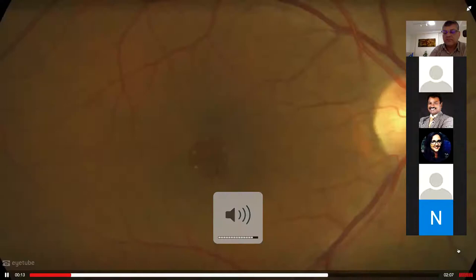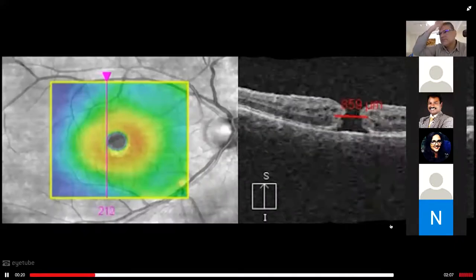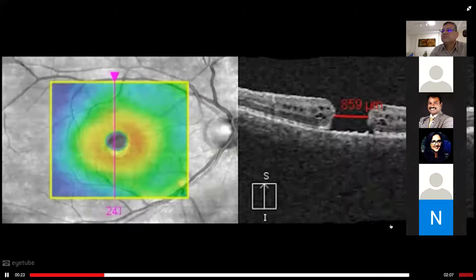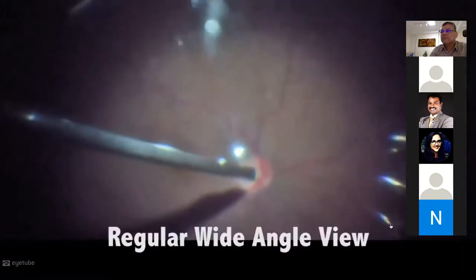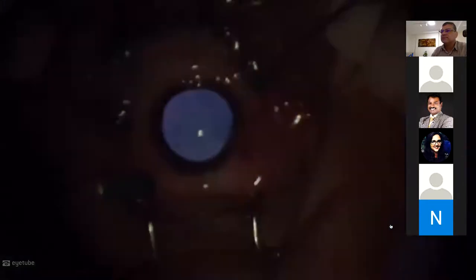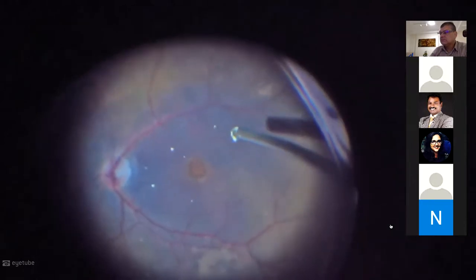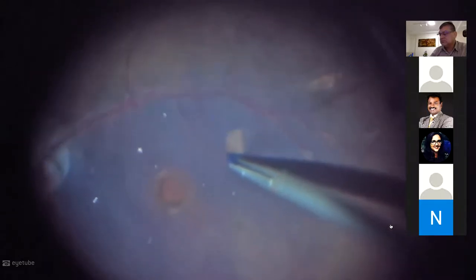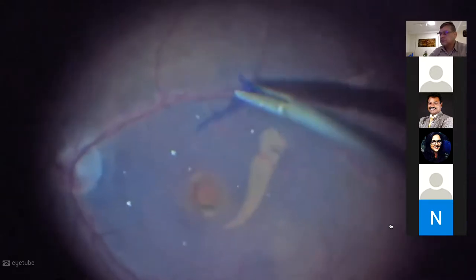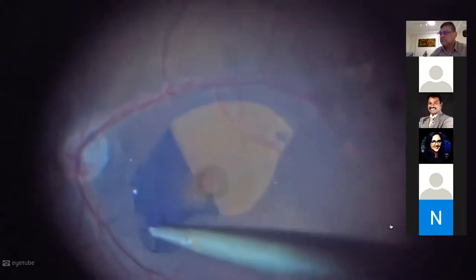These are the pre-op OCTs and FA. The macular hole measures 844 microns as measured by OCT — it is a large stage 4. The hyaloid is already detached. After brilliant blue staining, you actually have a very good view of the ILM. We open a vertical tear in the ILM, then start the peel in a capsulorhexis-like counterclockwise movement, lifting the internal limiting membrane and relieving all traction around the macular hole.